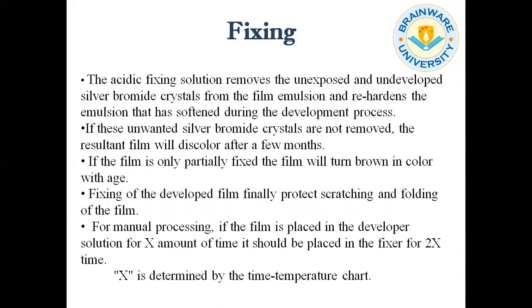And one more important thing: if the developed film is partially fixed, it will turn brown in color with age. Fixing of the developed film finally protects against scratching and folding of the film.